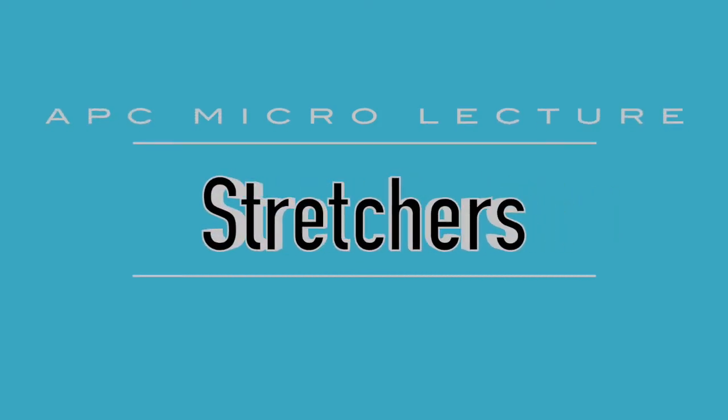Hey guys, in today's micro lecture, we're going to talk about ambulance stretchers or trolley beds. Most ambulance services have their own type of stretcher, and their choice of stretcher depends on a whole range of factors, including cost, size of workforce, location, and a whole range of other factors too.